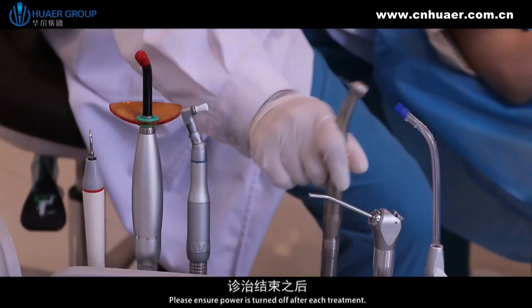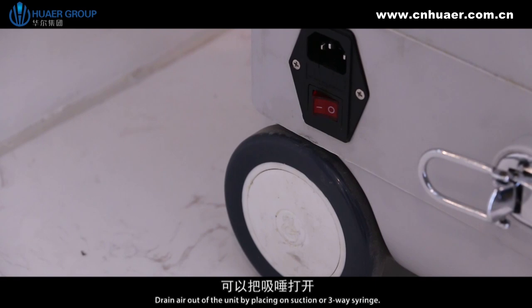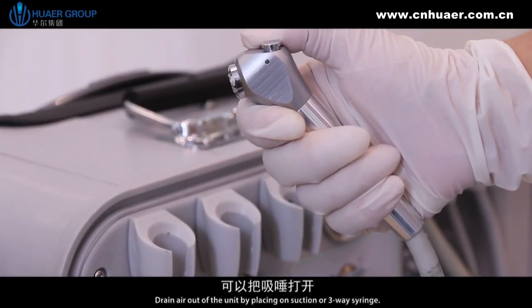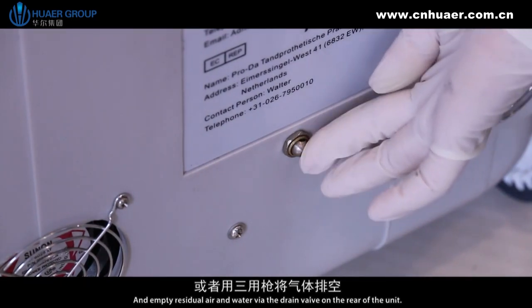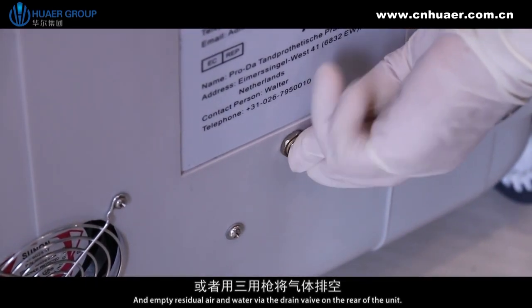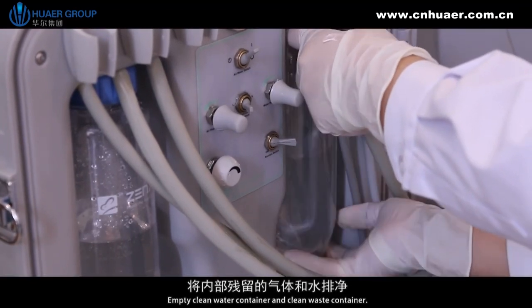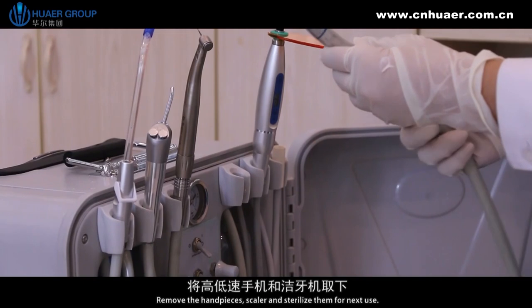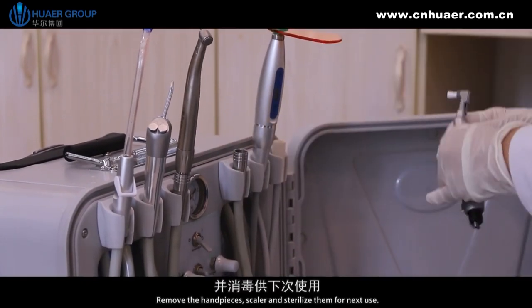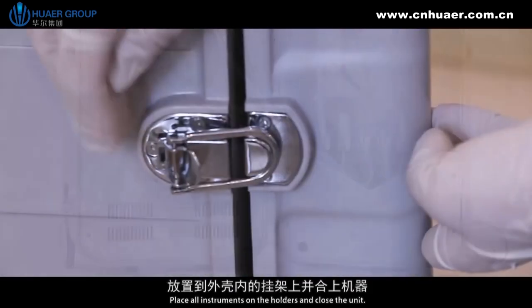Please ensure the power is turned off after each treatment. Drain air out of the unit by placing on the suction or three-way syringe, and empty residue air and water via the drain valve on the rear of the unit. Empty the clean water container and clean the waste container. Remove the handpieces and scaler and sterilize them for next use. Place all instruments on the holders and close the unit.